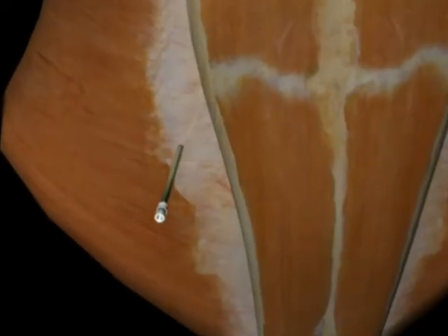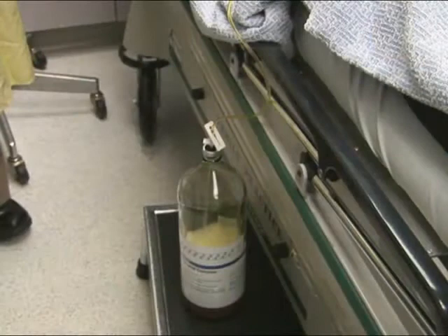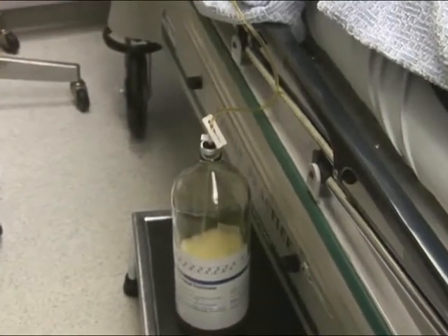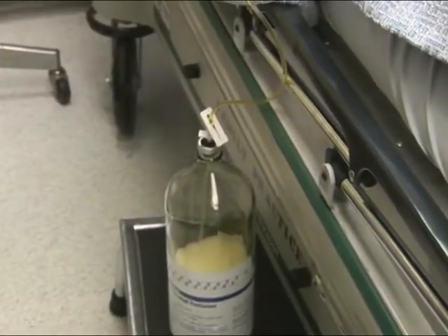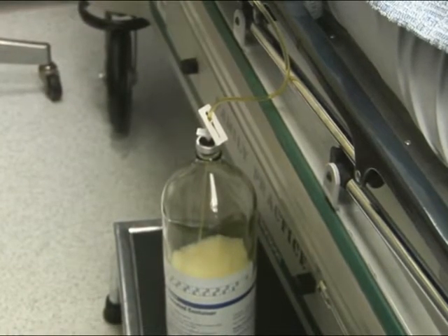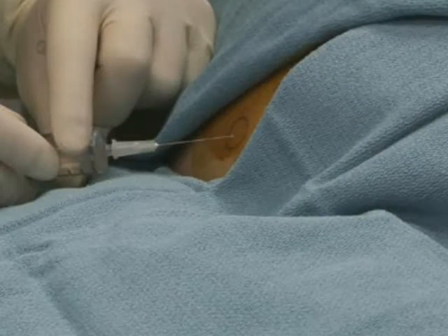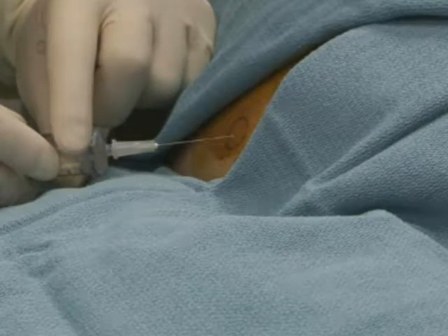Paracentesis is performed for diagnostic or therapeutic reasons in patients with ascites. The volume of fluid removed varies by the patient's pathology and reason for the procedure. For most paracenteses, remove as much volume as possible, though taking off more than 10 liters may cause significant volume shifts and hypotension. Patient comfort is paramount, so placing a good anesthetic block is essential.